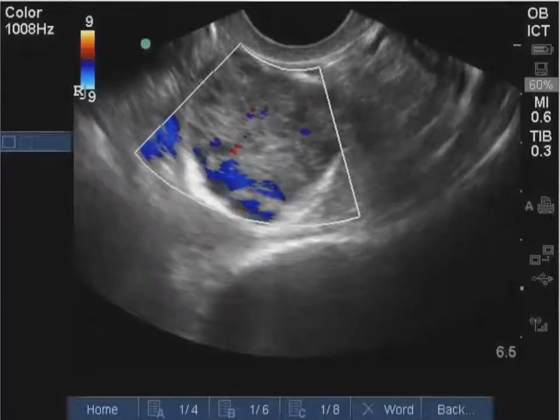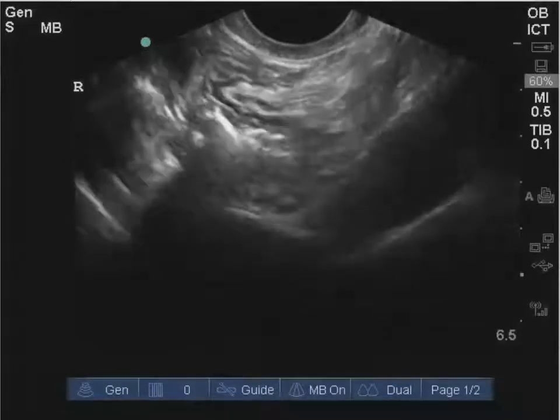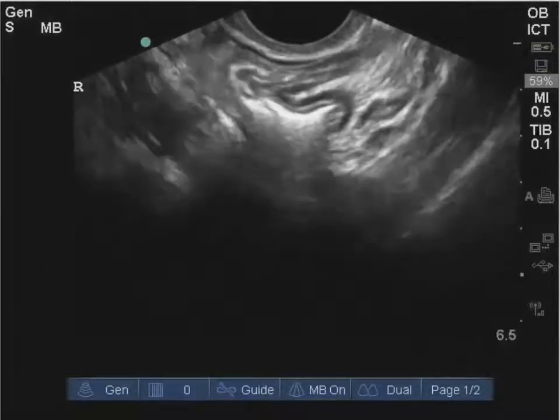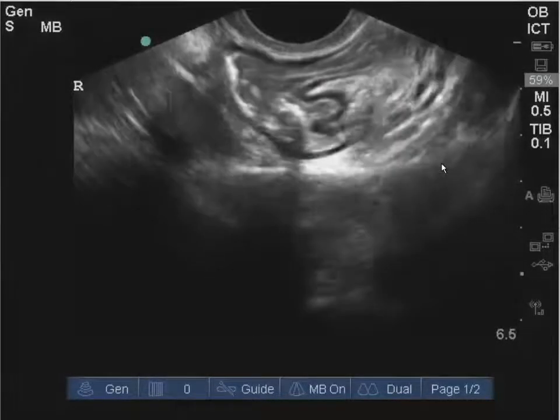So this was a middle-aged female and she came in with some pretty sudden onset lower abdominal pain, and so obviously some ovarian pathology was on the differential, so we took a scan of her abdomen or of her female pelvis via an endovaginal route. You can see here we got this tight curve and this wide field of view. So this is an endocavitary ultrasound, and a few things we saw in her pelvis.